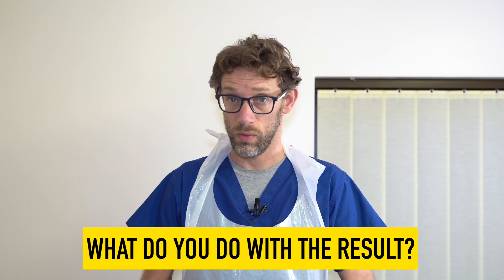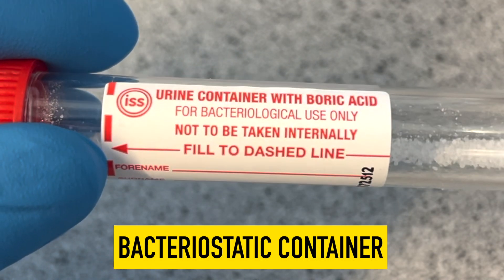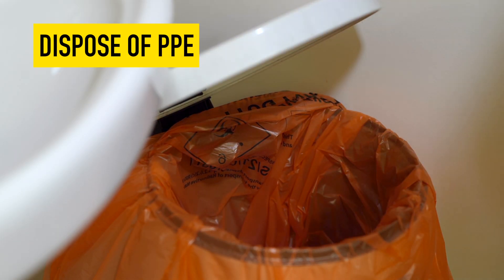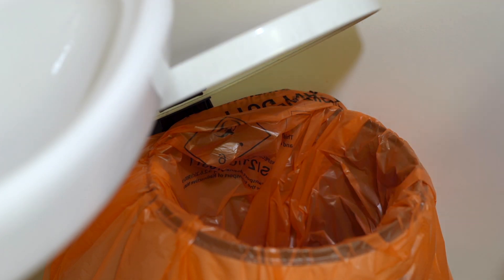Once we've completed the test with our reagent strip, we're going to determine what we need to do. If it's a negative test with nothing in it, then we can bin the sample in appropriate clinical waste. If however we've found evidence of an infection, we may need to transfer to a different bottle — the red-topped container containing boric acid — so that we can send that off to the lab for microscopy, sensitivity and culturing of any potential infections. We're then going to doff our PPE and place that in the same clinical waste bin.